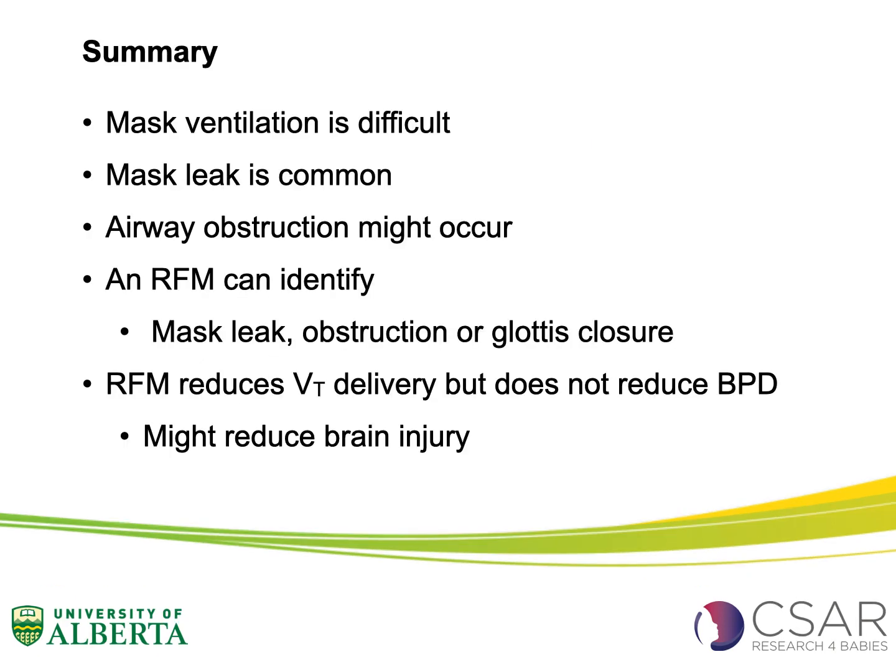Now, in summary, mask ventilation is difficult. You will often have a leak. Airway obstruction might occur, which might be glottis closure instead of airway obstruction. If you use an RFM, you can identify mask leak, airway obstruction, or glottis closure. The respiratory function monitor reduces tidal volume delivery, but does not reduce BPD or mortality, but it might have a role in the future to reduce brain injury.